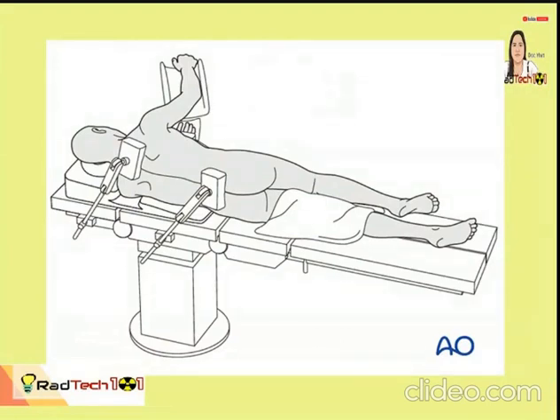So, this is what I'm telling you with the decubitus. The patient... what decubitus position is this? If this is the cassette, the IR, and here is the X-ray tube, what decubitus position is this? Position, Doc. Oh, position. Decubitus is a position.